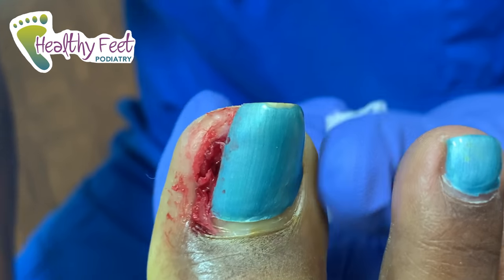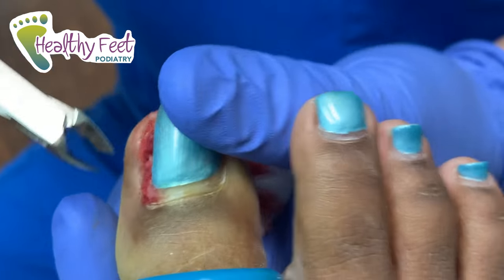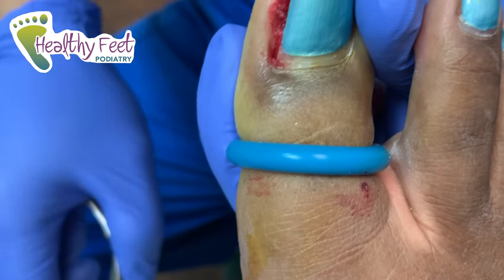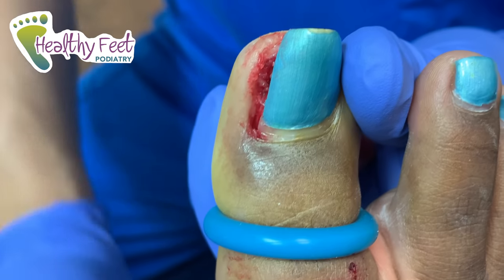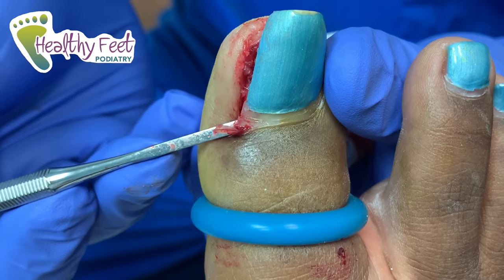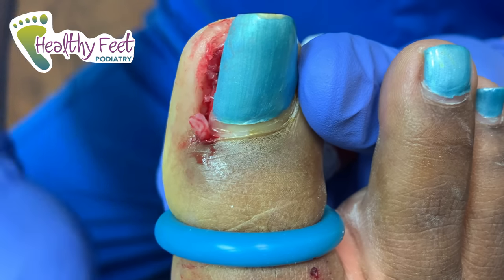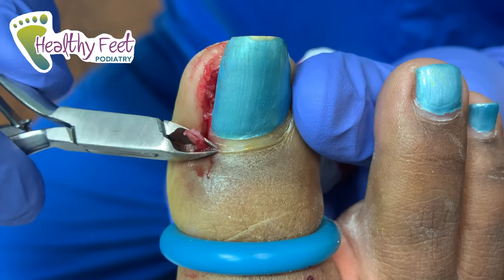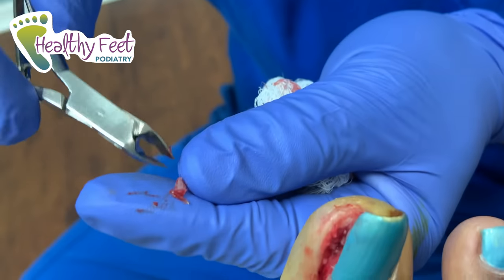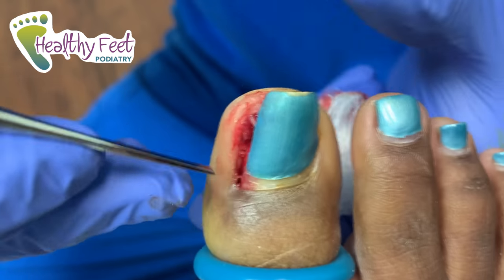Okay, so let's clean all the rest of this nail out. We'll make sure we didn't leave any nail matrix in there — we don't want regrowth, right? One done, baby. I think there's a small piece in there left, I see something. So we're going to try to fish it out here. There it is. I'll cut that out. When infections happen, that's because sometimes doctors leave this in there. So I got to be extra careful taking them out.